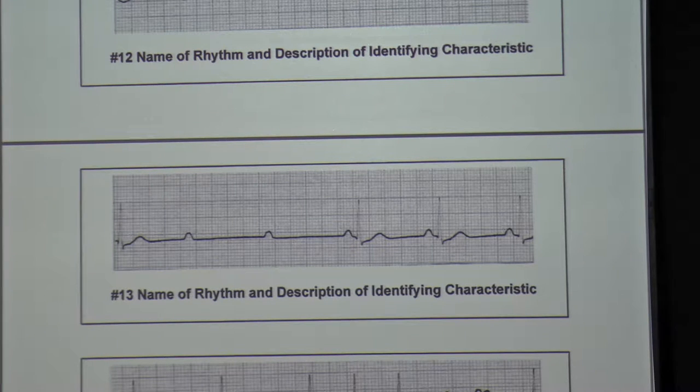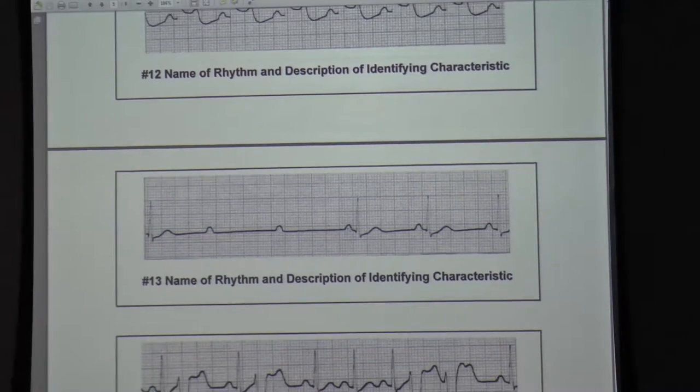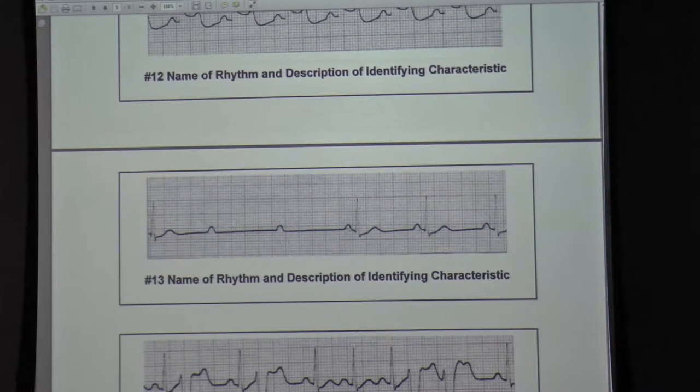So here, what is the AV node doing? Some P waves, it blocks, doesn't let through. The reason we're seeing the P wave is, remember, this is a block of the AV node, so everything above the AV node is working. So the SA node fired, it just never got through the AV node down to the ventricle. That's why you don't have a QRS. But occasionally it lets them through. So some it blocks, some it lets through. The ones where it lets through, you have constant PR intervals. So that's showing there's still some relationship between the atrium and the ventricles.